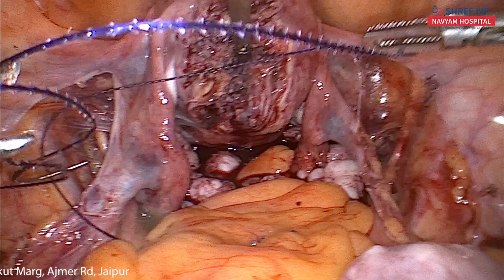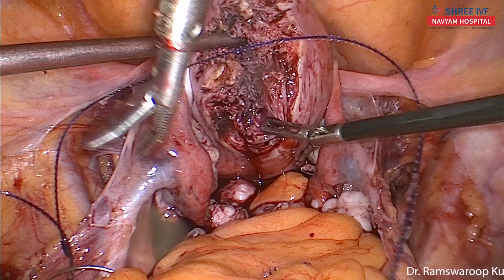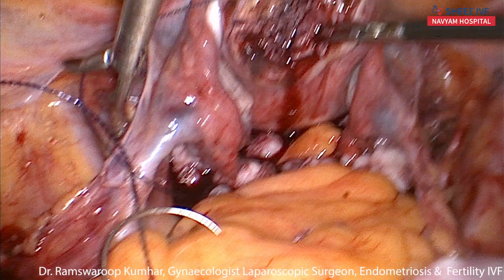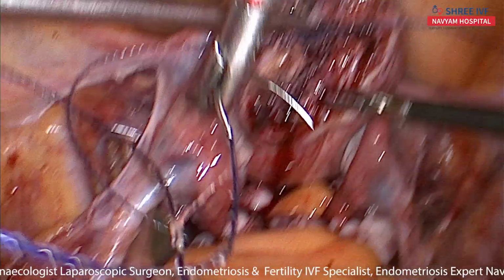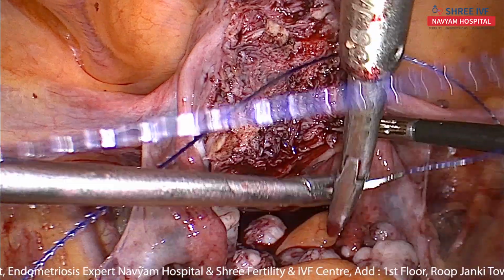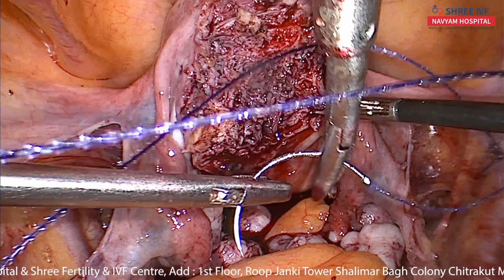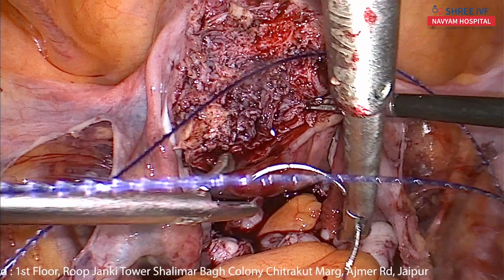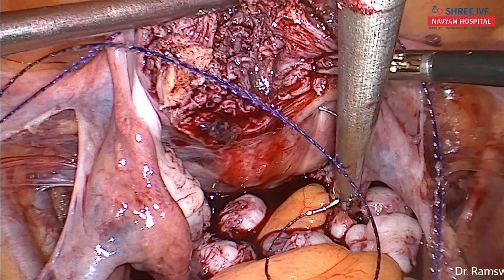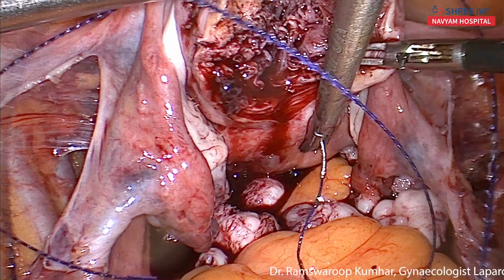Good. And I will try to use my middle port for this suturing. I am not an expert in this port suturing, so I will face some difficulty, but let's try. This is the first bite at the angle.